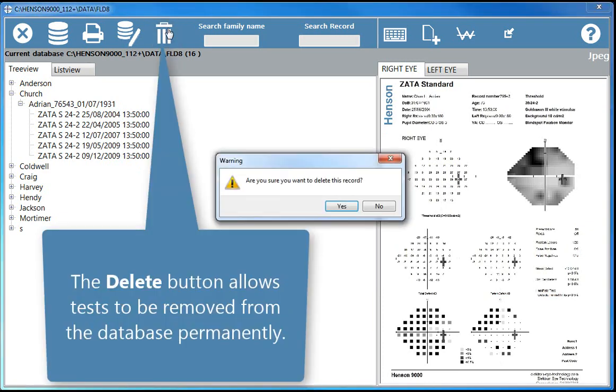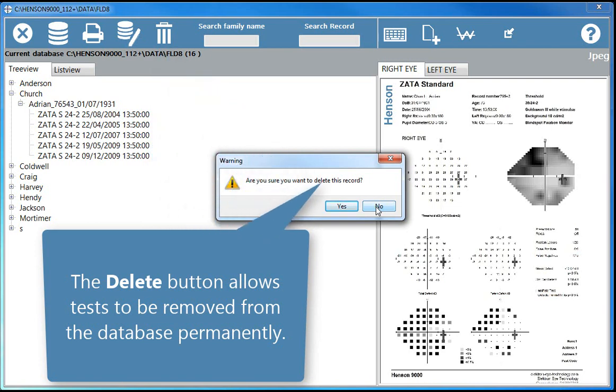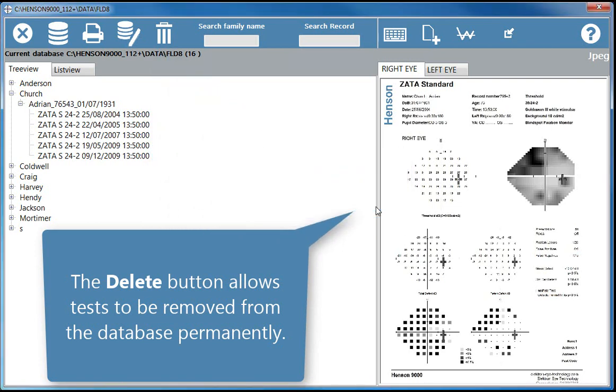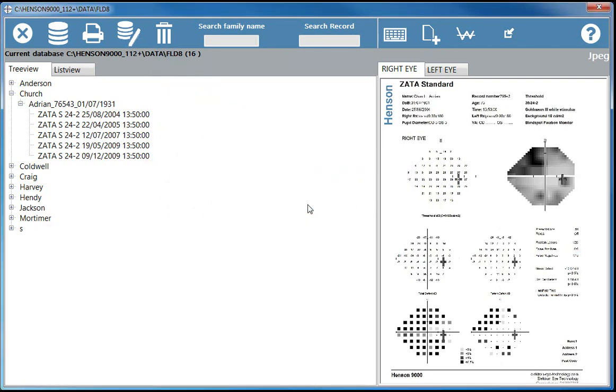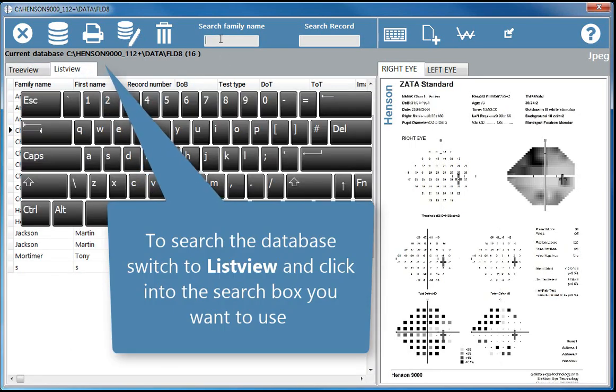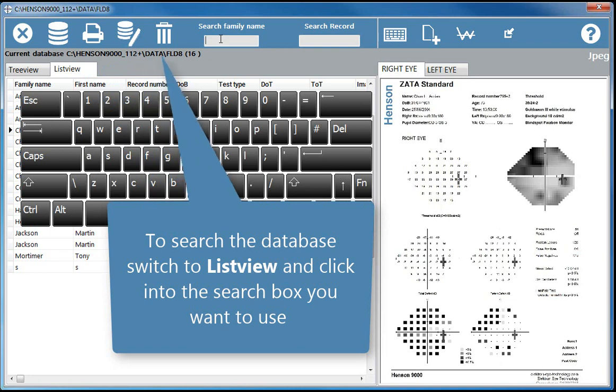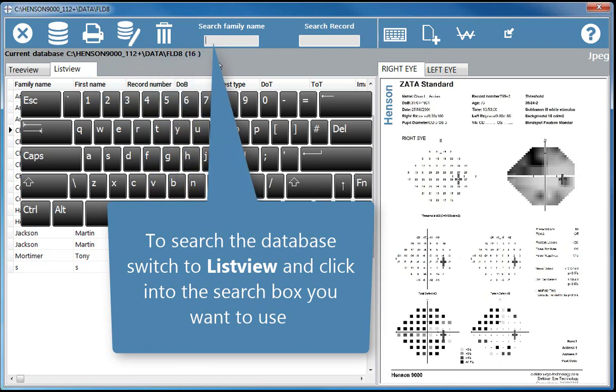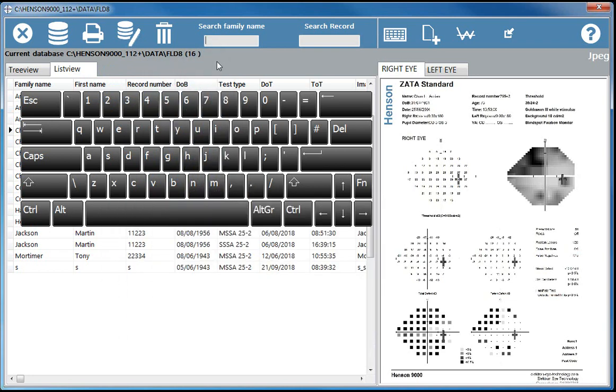The delete button allows tests to be removed from the database permanently. To search the database, switch to list view and click into the search box you want to use.